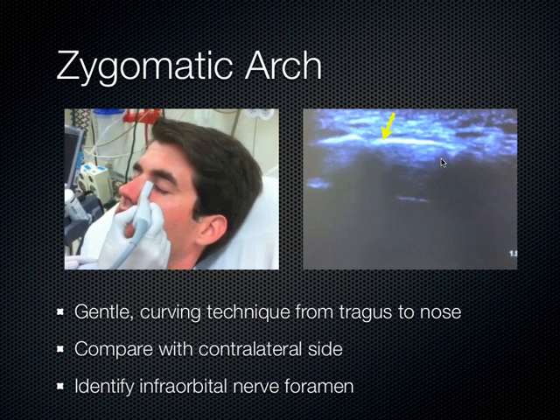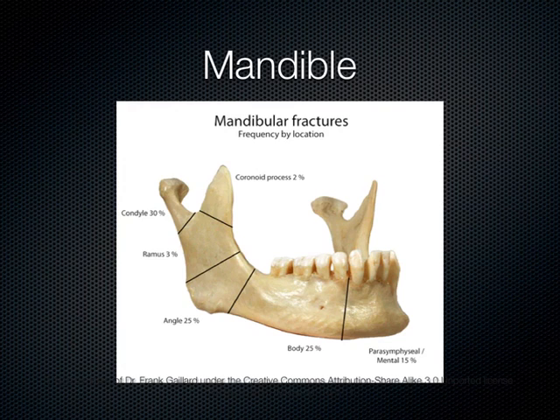If you're looking for fractures, obviously, as we're doing this, when a patient comes in after blunt trauma to the face, and if there's any discontinuity or depression along that hyperechoic cortex of the zygoma, then you're suspicious for a fracture, although it's easy to identify that little step off over here. But that's just, again, that infraorbital foramen.